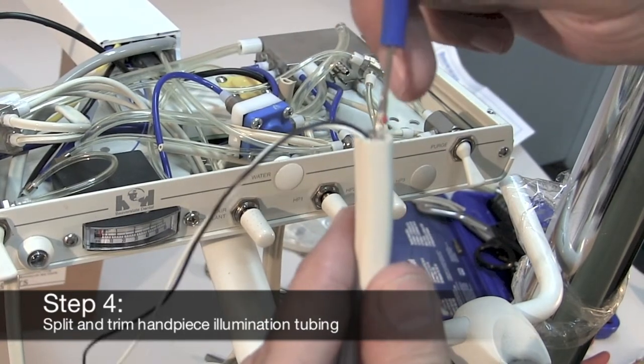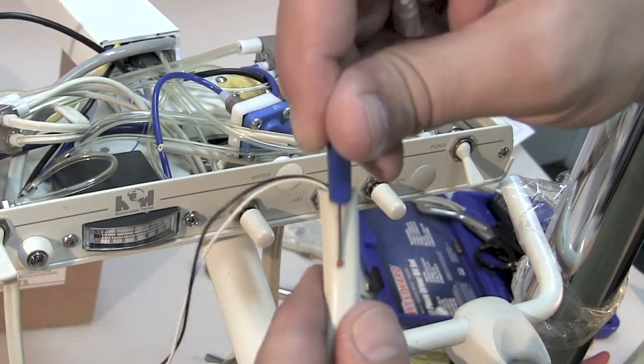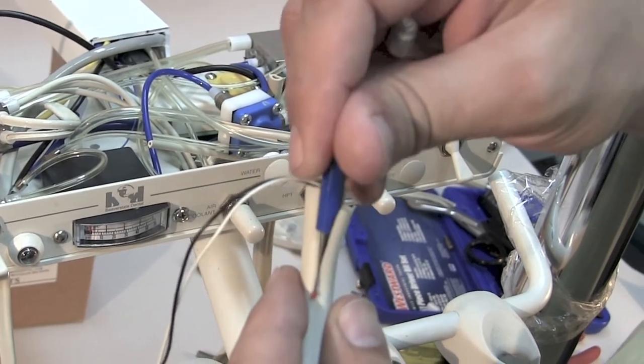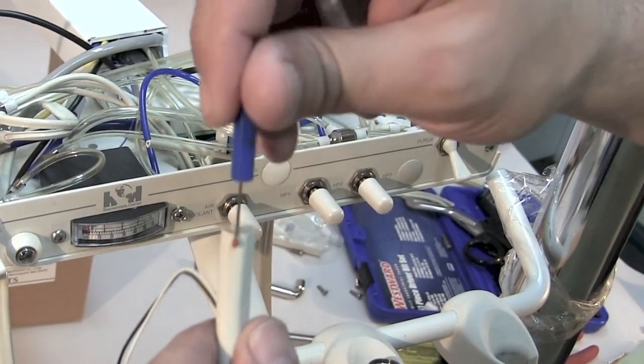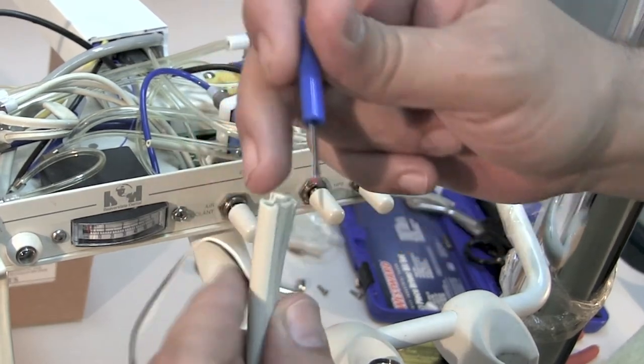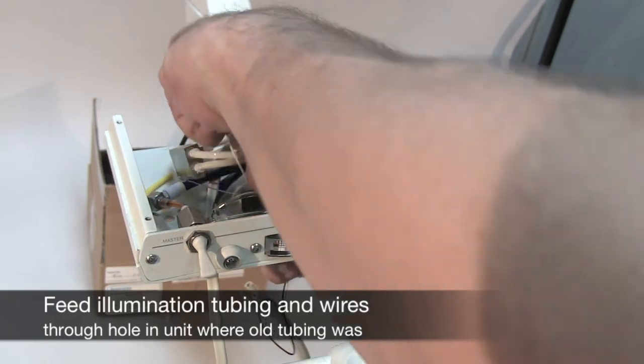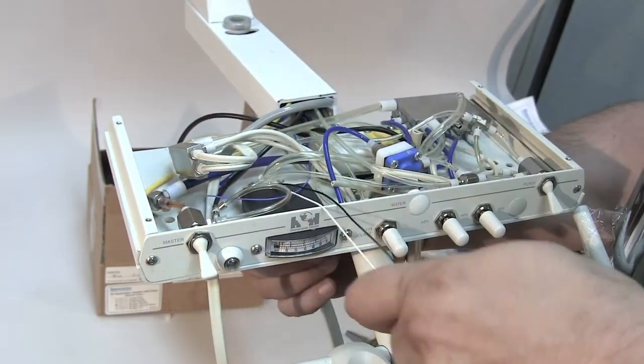Get your illumination tubing, split the lines and trim them to the desired length. Make sure to leave extra length on the wires so that they can reach the air electric control. And feed the tubing through the hole where the old handpiece tubing was, which in our case was in the bottom of the unit head.